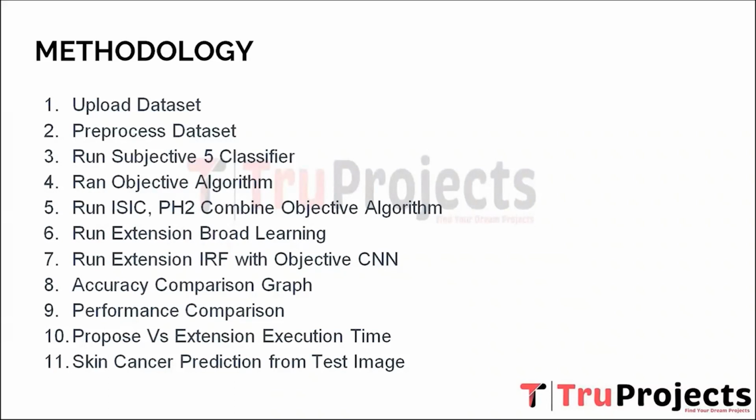Seventh, run extension IRF with objective CNN. Another extension technique applied is the integrated receptive field, IRF, with the objective convolutional neural network, that is CNN. IRF enhances the neural network's receptive field, enabling it to process larger image patches effectively, leading to improved feature extraction and classification accuracy.